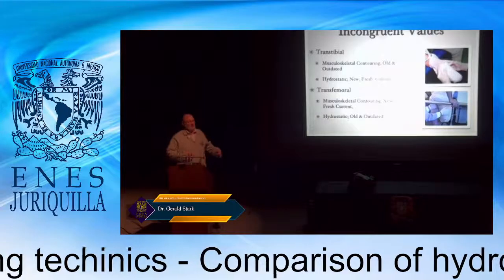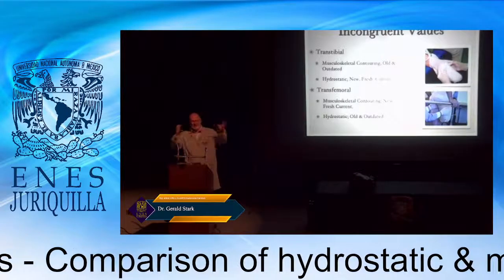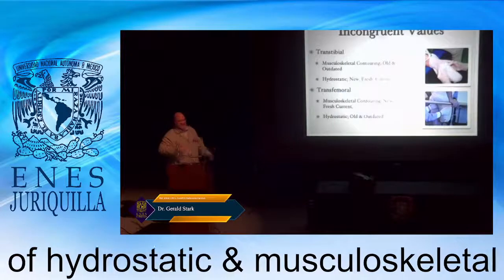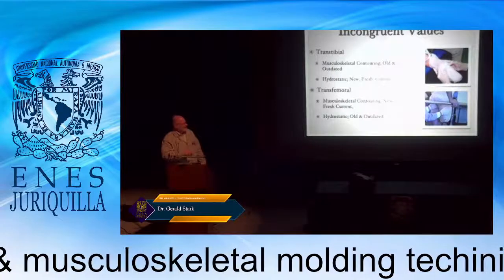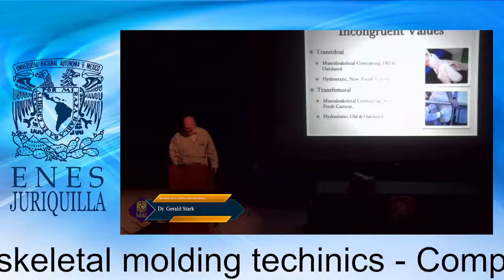But even between transtibial and transfemoral, musculoskeletal contouring, that's old. Hydrostatic total surface bearing, that's new. But if we just go above the knee, musculoskeletal contouring, ischial containment, that's new, right? Hydrostatic methods, that's old. You see what I'm saying? It's actually both. We actually use both.